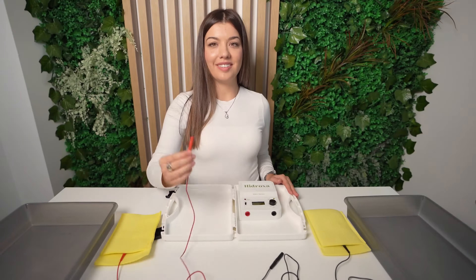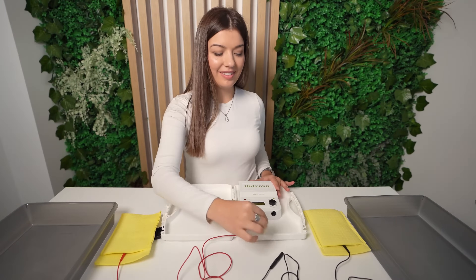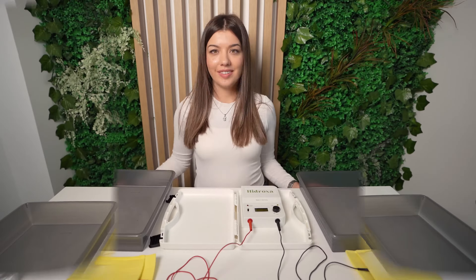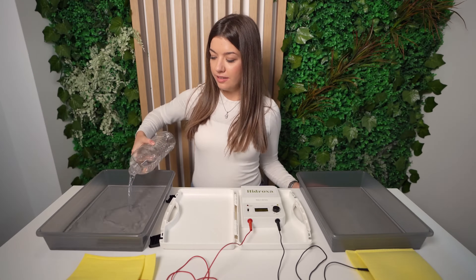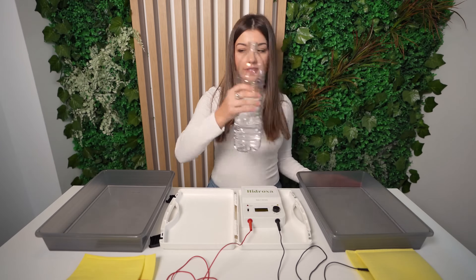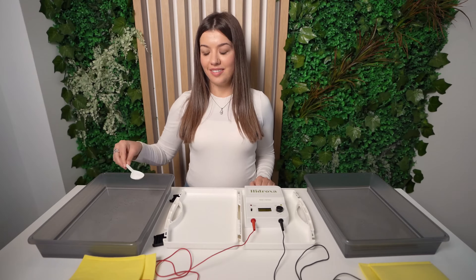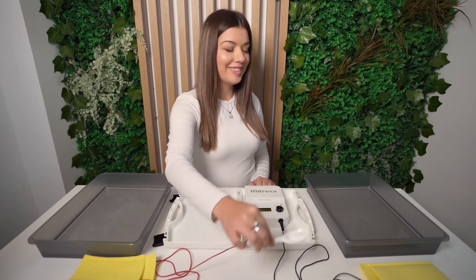Let's start. Please check that the electrode cables are connected to the electrodes and to the machine. Make sure the charger is not connected to the machine. After this, pour water into the plastic containers. Make sure that the water covers the area you wish to treat, and no more than that. Add a teaspoon of salt into the water in each container. We recommend everyone to do this.